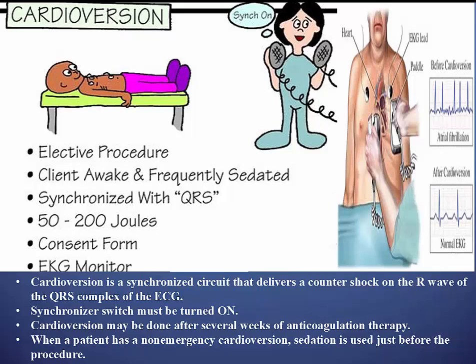The cardioversion may be done after several weeks of anticoagulation therapy. When a patient has a non-emergency cardioversion, sedation is used just before the procedure.